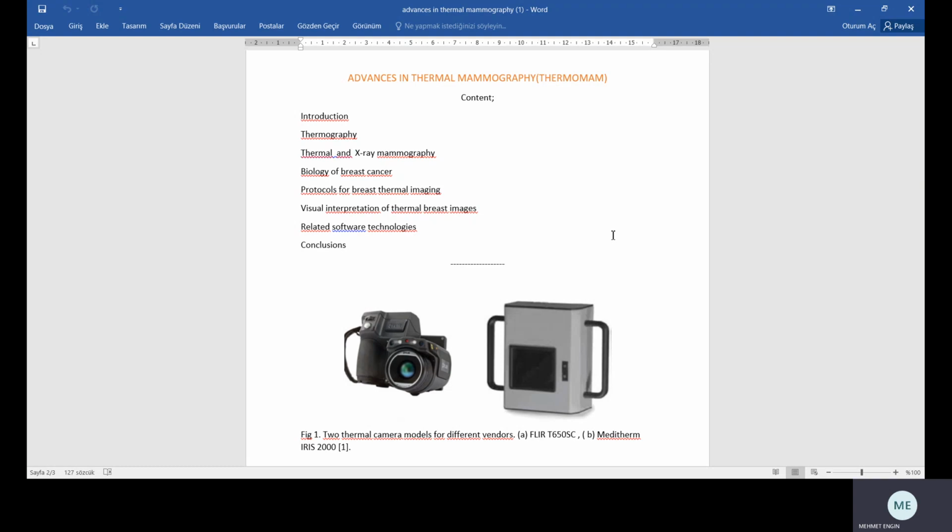Niramai software provides automated tagging support. This reduces the error of wrong naming or tagging, which in turn would result in other errors such as segmentation error and misclassification of the subject. This software automatically tags the views based on the body border curvature and the body area.